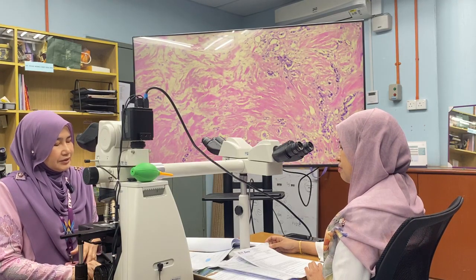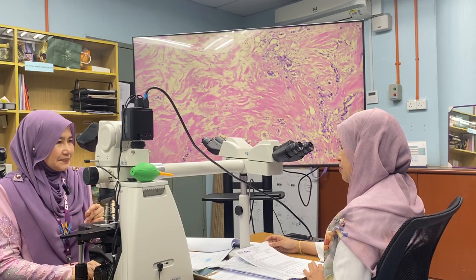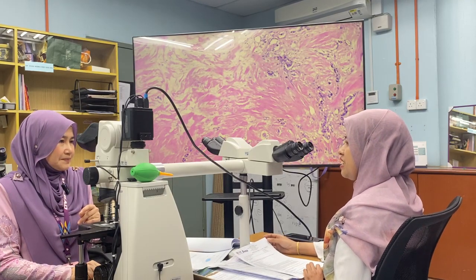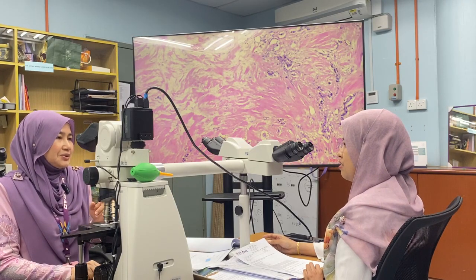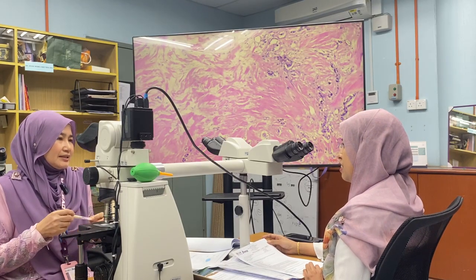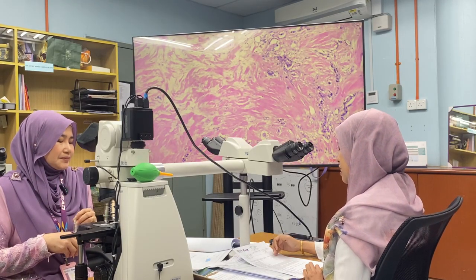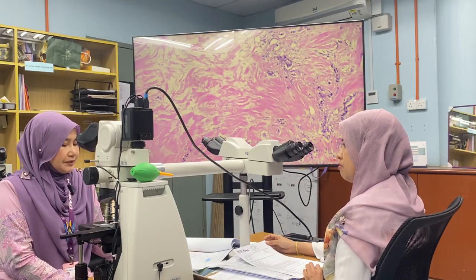What about DCIS? Do you see any DCIS in your case? In the specimen that I have examined, there is no DCIS noted. If you have DCIS, what should you do? We need to grade and also report regarding the DCIS. What do you mean by grade DCIS? It's low grade or high grade DCIS, and also the size and the distance of DCIS to the margin. All right. And then, do we need to assess post-chemo changes in DCIS?